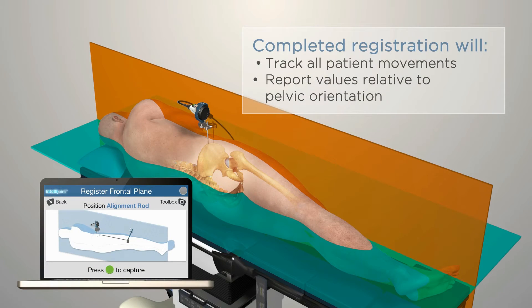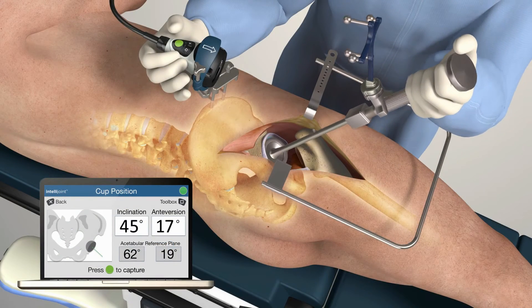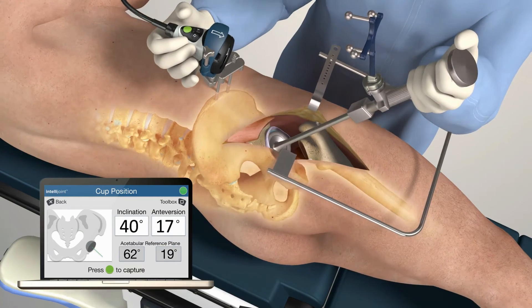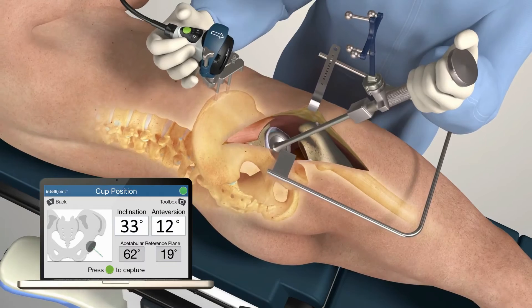A simple registration is completed following accurate positioning of the patient and prior to the primary incision. IntelliJoint HIP tracks patient movement and reports values relative to the current orientation of the pelvis, providing accurate real-time anteversion and inclination angles, which assist in the implantation of the acetabular cup.